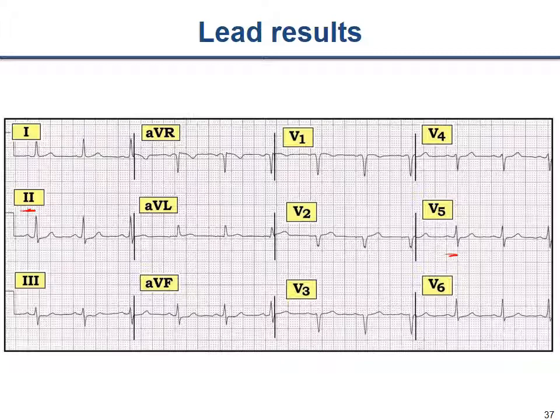So this 12-lead picture is a classic clinical picture, and it does give a lot of useful insight. Now, if we only gave you lead 2, for example, a clinician may not have enough information to perform a deep diagnostic on what's going on in certain areas of the heart versus others. So that's why we have all these different leads.